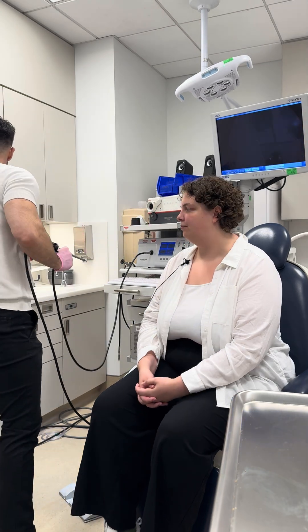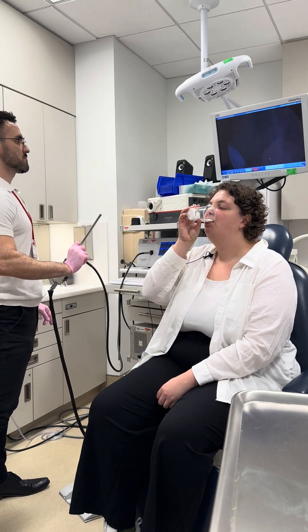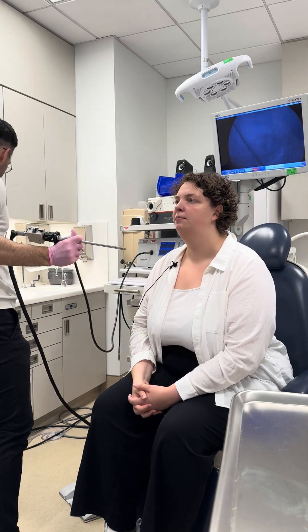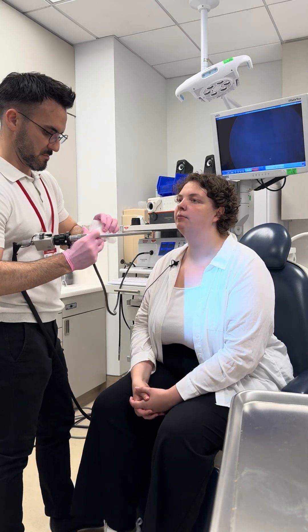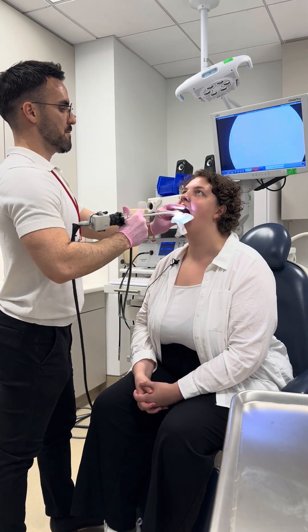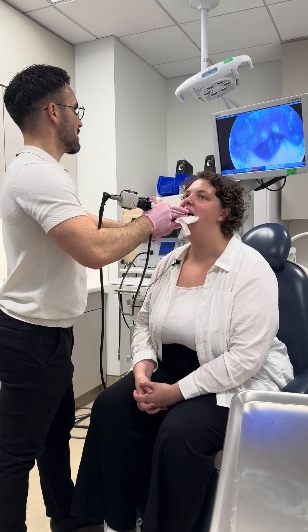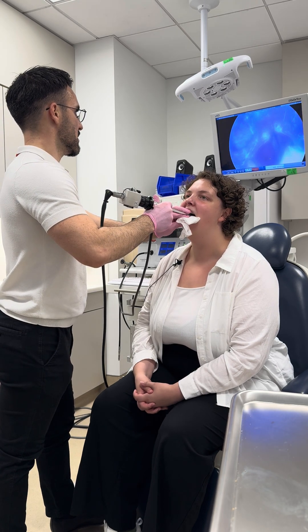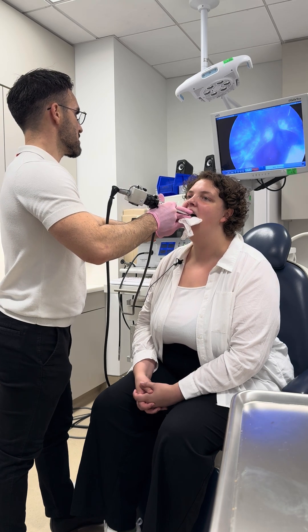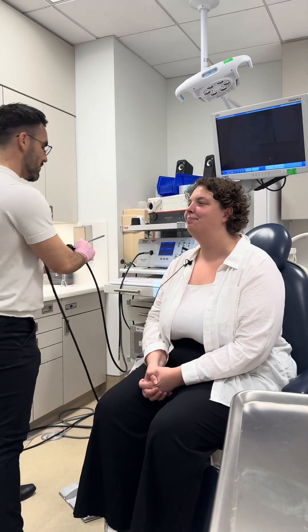All right, let's just finish it. Excellent. Good, straighten your back. Good. Chin up a little bit. Gently bite down, smile and say eeeee. Good. And do it again. Good. Check your jaw. Good. Yeah, that's okay. All right, all set.